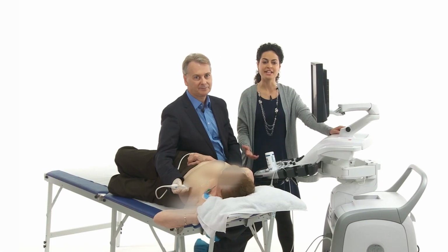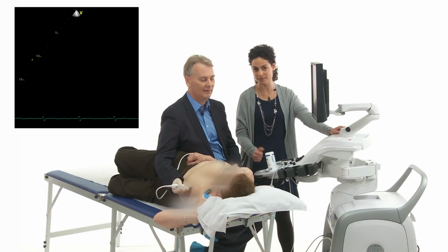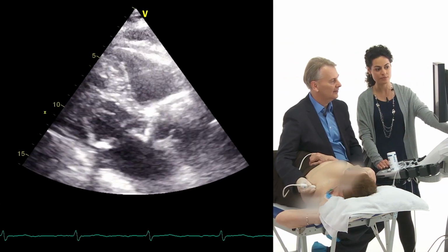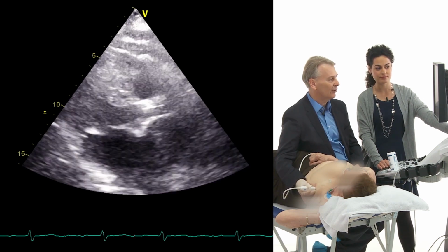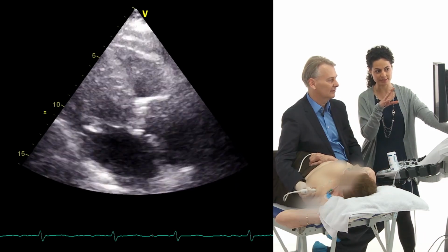I want to go to a patient because you need to find out more about the pathology we'll be talking about. And here we have an 85-year-old woman who came for dyspnea and after a systolic murmur was detected. And we want to do echo to see what's the real problem. So this is a little bit of an atypical parasternal long axis view. She's actually not so easy to image, a frequent problem in elderly patients. But still, we can immediately detect the problem.